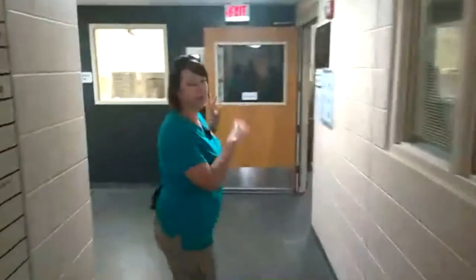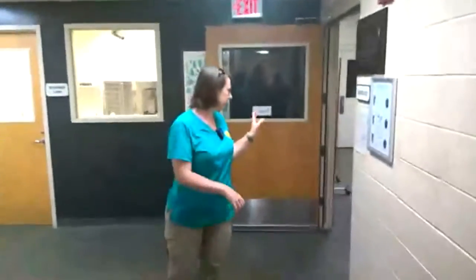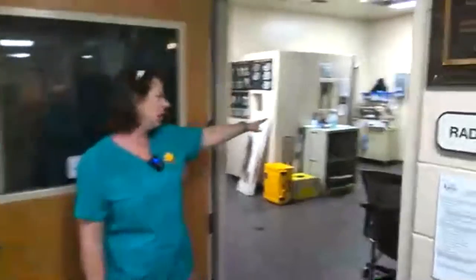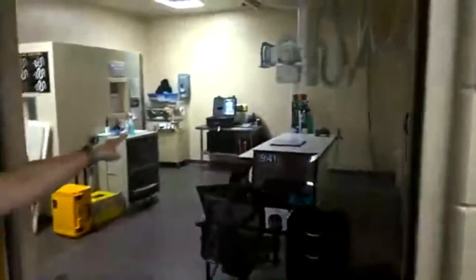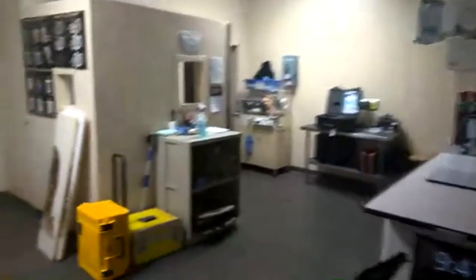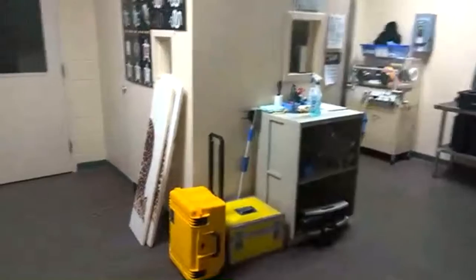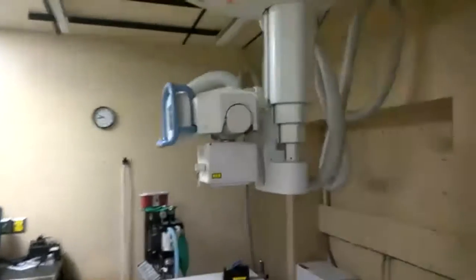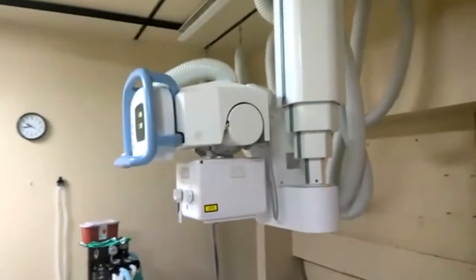The larger animals, if we have to treat them, we're usually going to treat them in their space. We actually have radiology in here. That little plate that's on the table right there, it can travel. That little plate and this little orange box is traveling equipment. So a lot of our machines are portable. We have a portable anesthesia machine. We have portable radiology. The majority of what we use can be moved to where the animal is.